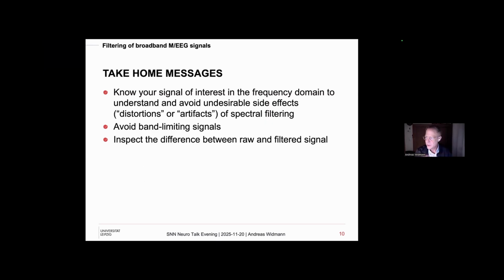Even if nothing looking like an oscillation is in your time domain signal, in the frequency domain, it's there. And if you remove it, you will get problems. But it's a wonderful tool. The first example with the Gaussian in noise, I love that example because it demonstrates the power in an incredible way. It's like magic, but it's just math.